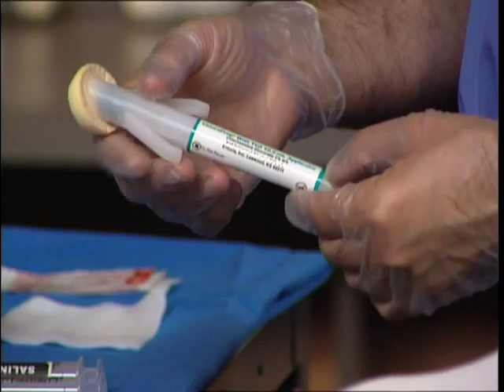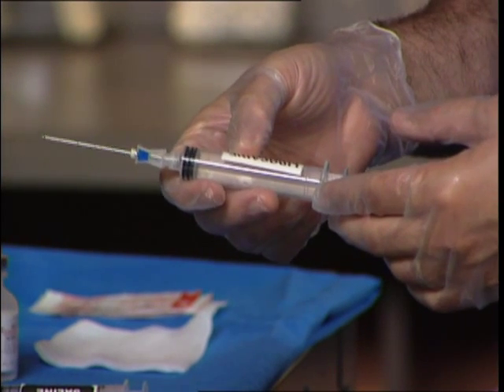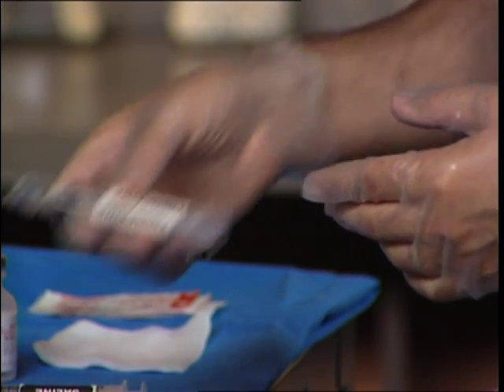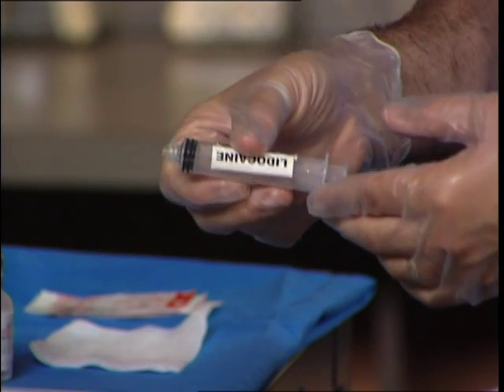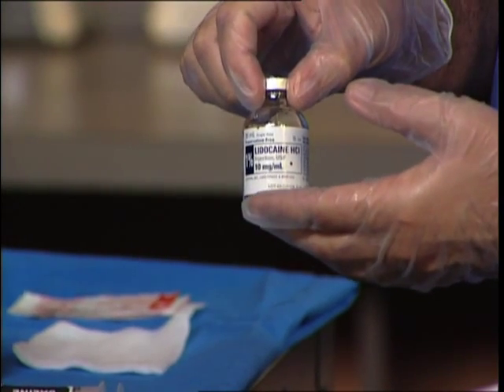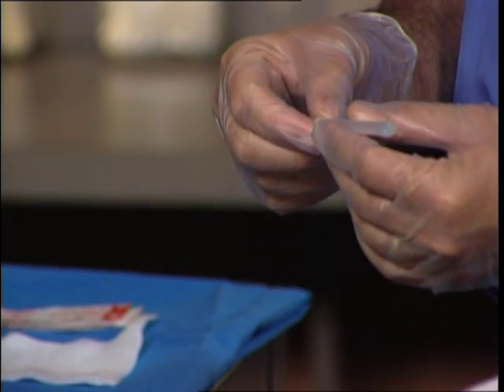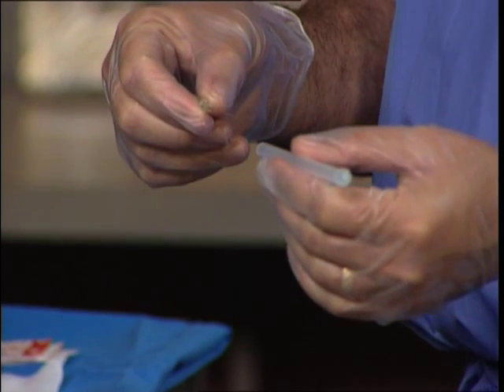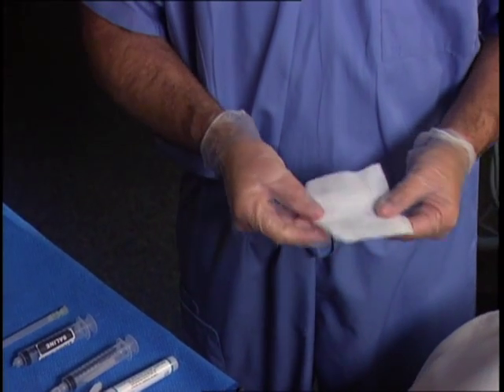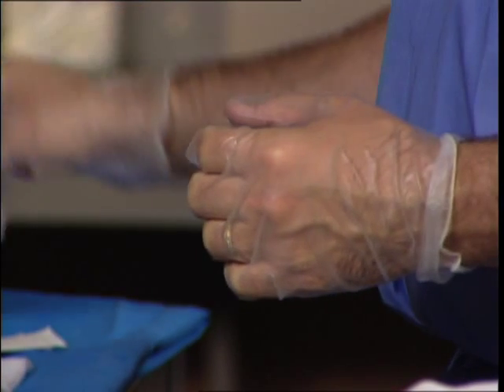In order to facilitate a proper block, the following equipment is required: a chlorhexidine prep for sterile technique; a local anesthetic syringe with a 27-gauge 1.5-inch needle for local anesthetic placement, preferably 1% bicarbonated buffered lidocaine; a syringe containing the epidural steroid mix composed of 1 cc of 1% lidocaine, 6 cc's of bacteriostatic saline, and 40 to 80 milligrams of triamcinolone (Kenalog), which is a particulate steroid; a 3.5-inch spinal needle to enter the space; sterile 4x4s for cleanup; and a simple band-aid to cover the entry site.